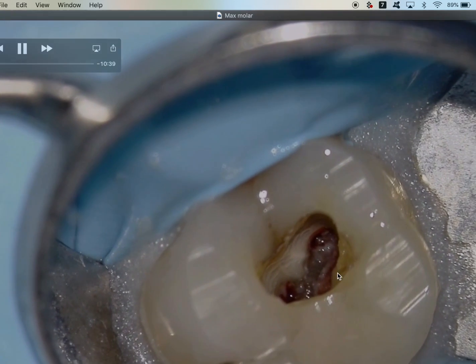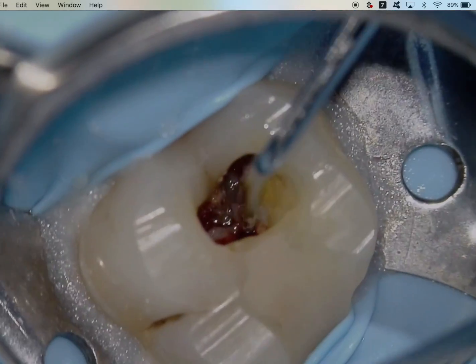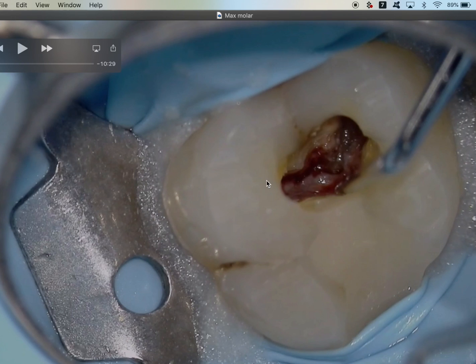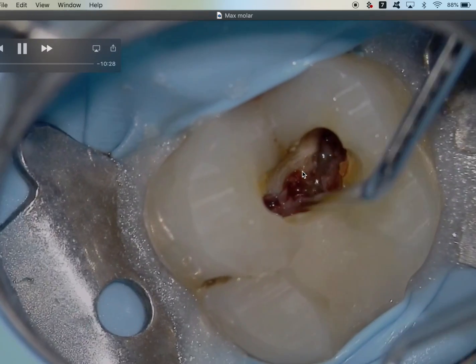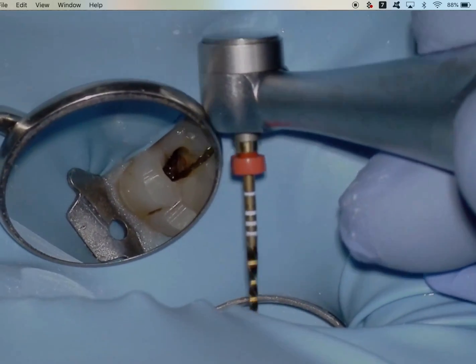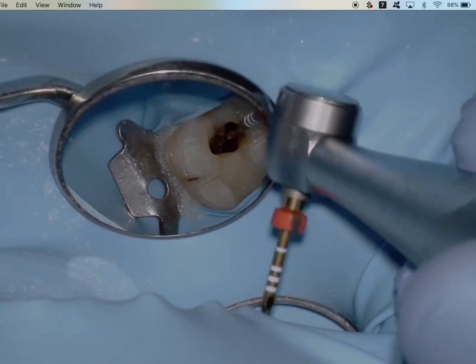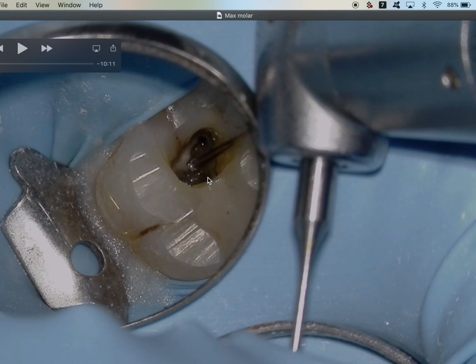I'm looking for the initial orifices but also looking to see if I can find MB2 quickly. In this case I can't find it easily, so I'm probing around — MB1, distal buccal, and palatal. A tip I showed before for orienting yourself: run a straight line from the palatal cusp to the MB1 orifice, then draw a bisecting line from the distal buccal. Where those two lines bisect is approximately where you'll aim for MB2. Since I can't find it, I'm going to open the coronal two-thirds and shape the main canals.